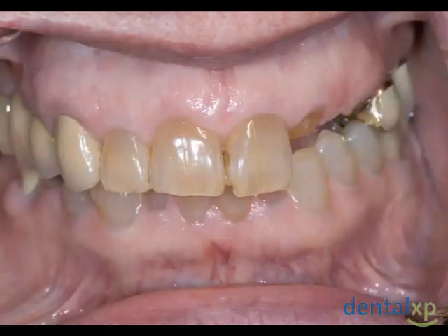The second case will show how proper emergence profile can be created with contouring an existing healing abutment. The patient presented with a broken bridge from the maxillary lateral incisor to the first bicuspid. The case was complicated by the fact that the maxillary left cuspid was impacted.